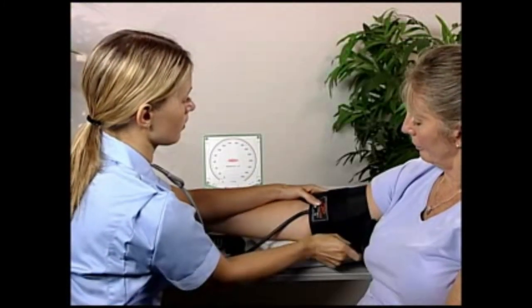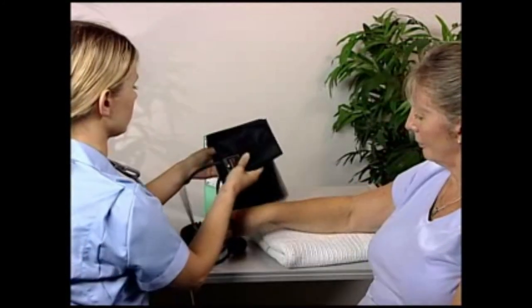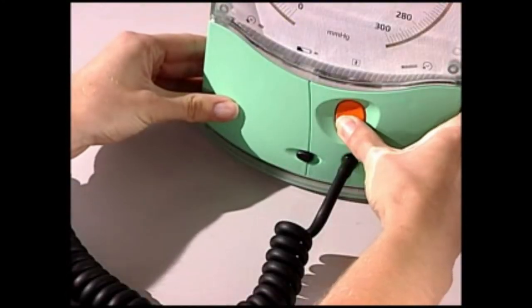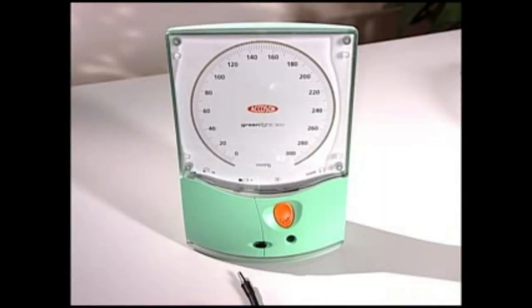When the blood pressure reading is complete, remove the cuff from the patient's arm. Leave the air control valve fully open to exhaust any residual cuff pressure. Then switch off the GreenLight 300 by pressing the orange button. If left on and the residual cuff pressure is below 20 millimeters of mercury, the device will automatically switch off after one minute to save battery power.